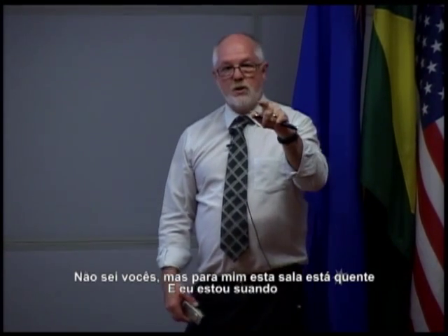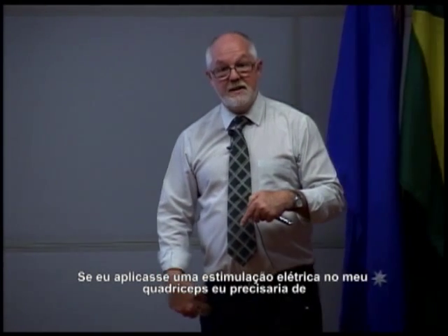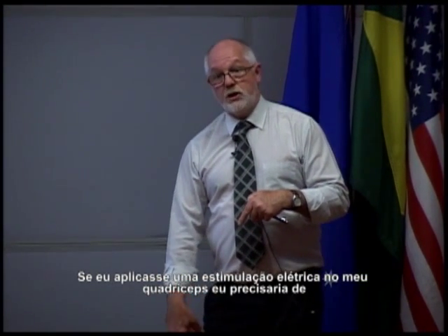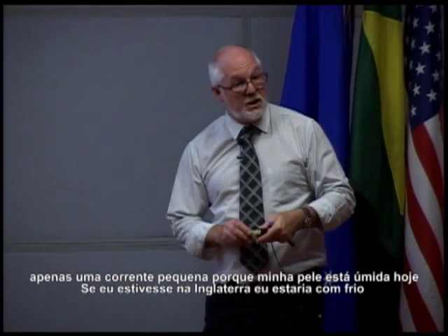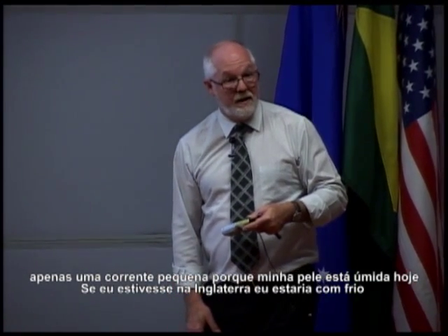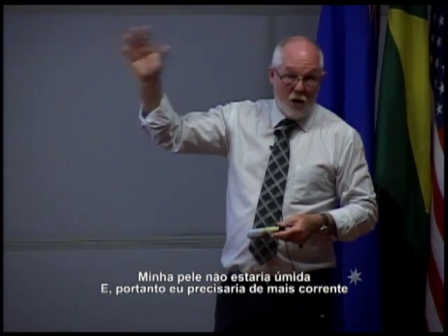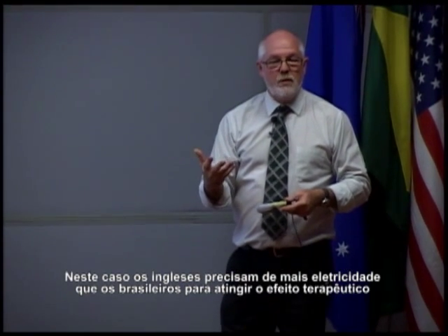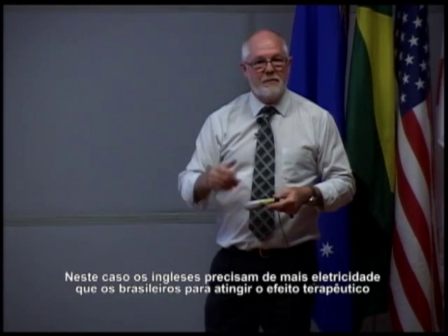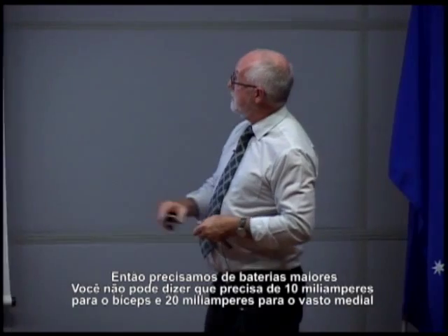I don't know about your side of the room, but up here it's hot, all right? I am getting wet, all right? And therefore, if I did electrical stimulation to my quadriceps, I would only need a small current because my skin is wet today. If I was in England, I would be cold, my skin would not be wet, and therefore I would need more current. So English people need more electricity than Brazilian people to have a therapy effect. So we need bigger batteries, all right?